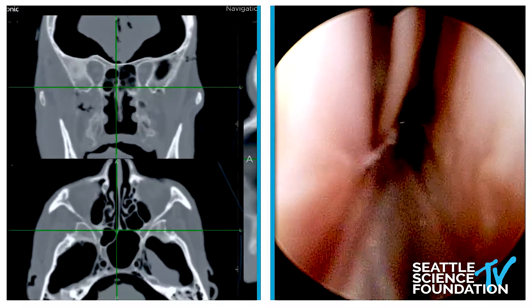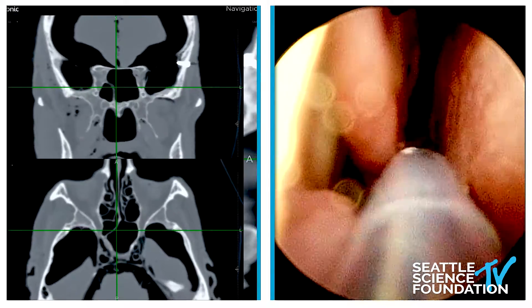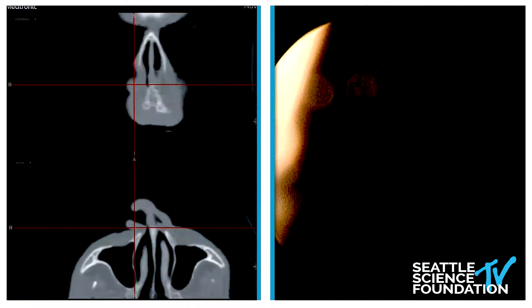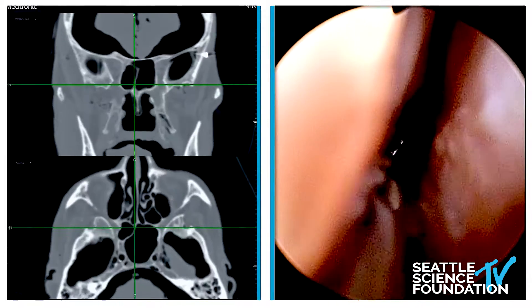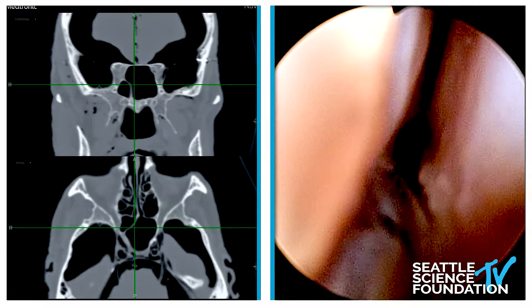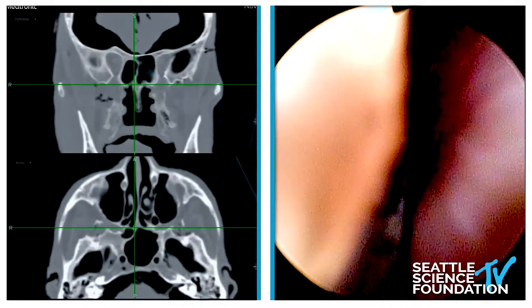It's going to be pretty hard to miss the sphenoid, and I like image guidance because it really lets you know where you are. Going in through the right side, you can see the os right there. You know where you are, and clearly if you look at the nav, I'm not in the left sphenoid — I haven't gone through the inter-sinus septum.